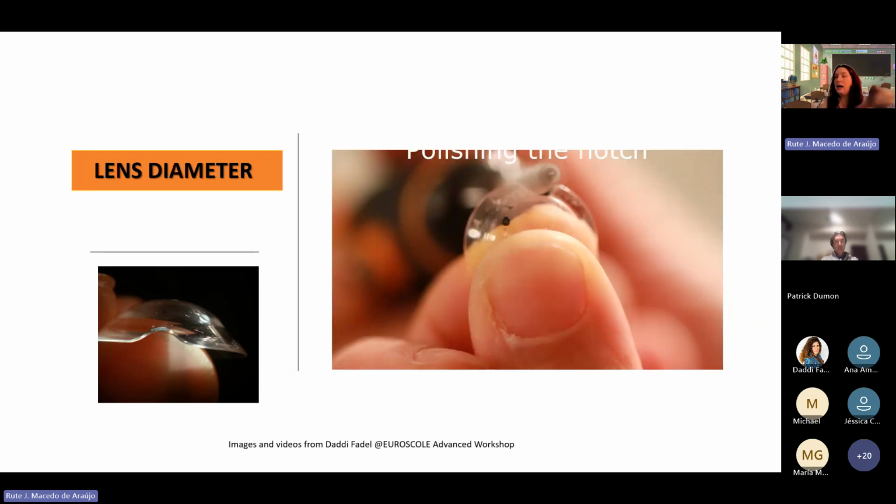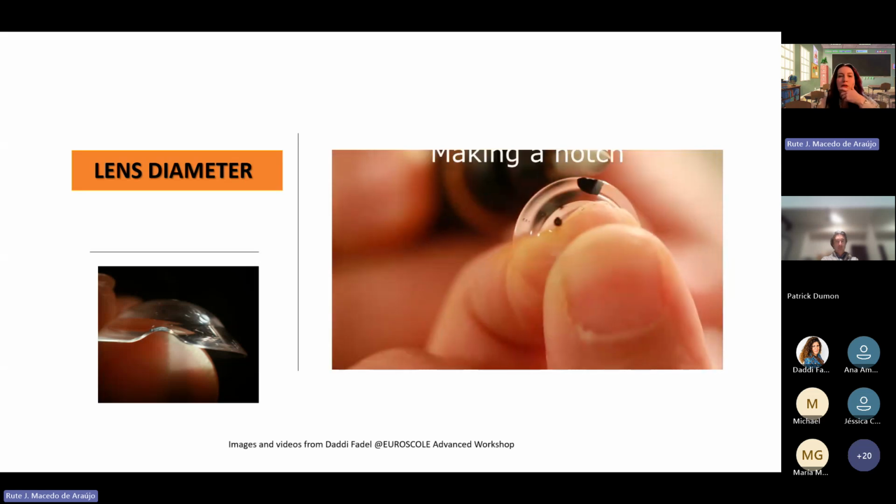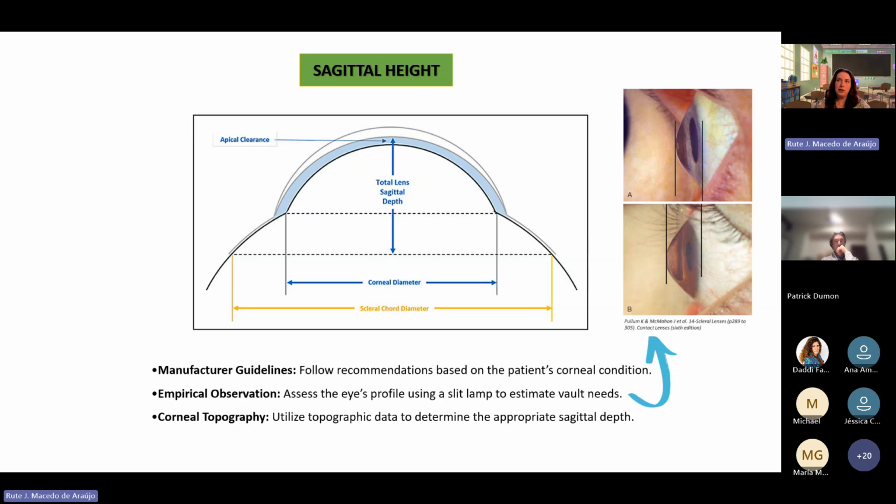And as you can see, there is no advanced equipment here to select the lens diameter. About the sagittal height, usually the manufacturers have some recommendations. If you have a normal cornea, use this as the first trial lens. If you have advanced keratoconus, use that one, and you can follow the manufacturer guidelines. Also, empirical observation, the things that I told you earlier. So yes, it requires experience, but if you start right now doing this in all your patients, you will be able to understand when you will need a higher sagittal height.